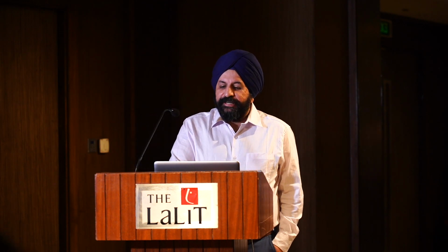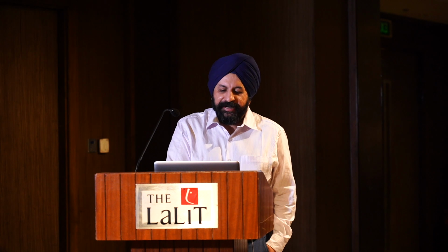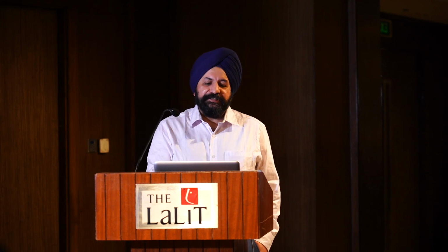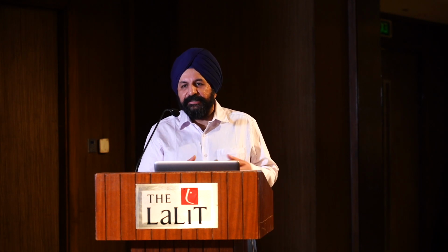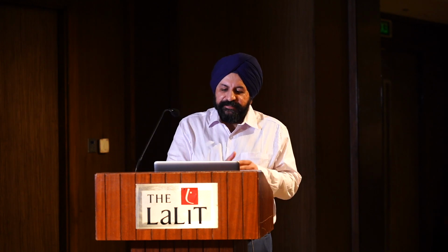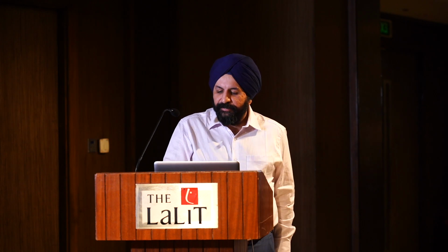So next is flow cytometry, which is the international reference method, but again because of cost considerations, we can't use it for routine practice. This last method has held us good even when we didn't have all this technology, which is the manual method using chamber and smear validation. And for some of us who are still on the basic hematology analyzer, this technology still works because it is dependent on the observer.